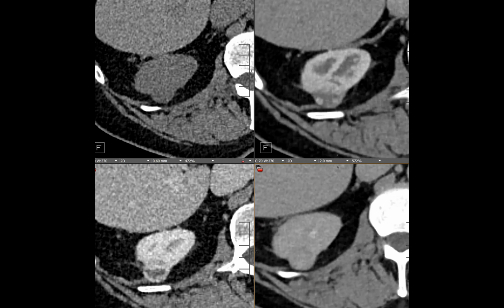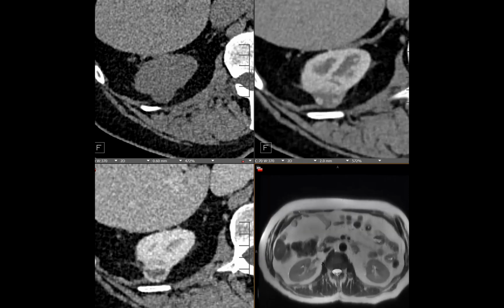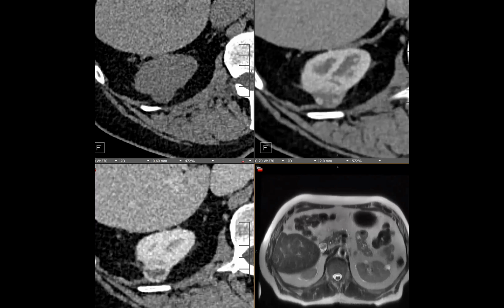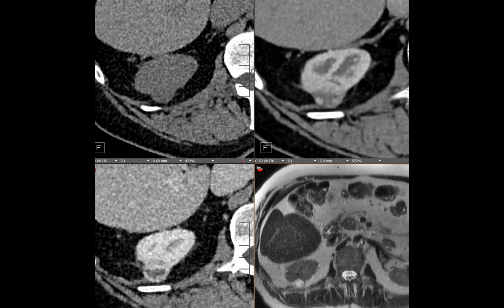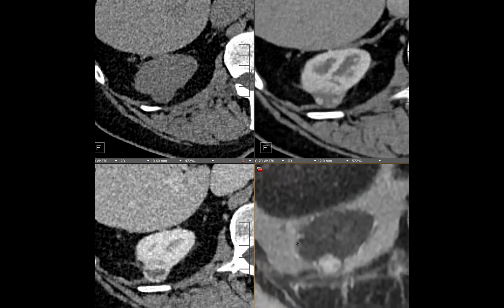Okay, I'll just say, sorry, did somebody say something? Oh man, where's my current? Sorry. It was an MRI and it fails the MR clear cell likelihood score. Okay, well, here's the MRI. Does it fail it?